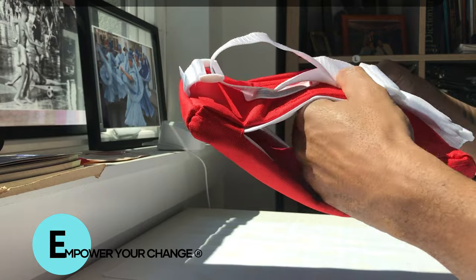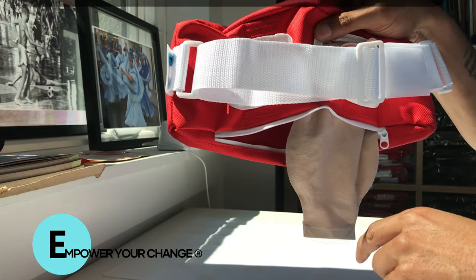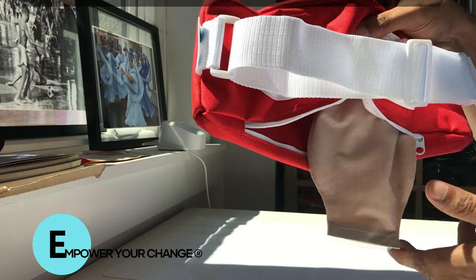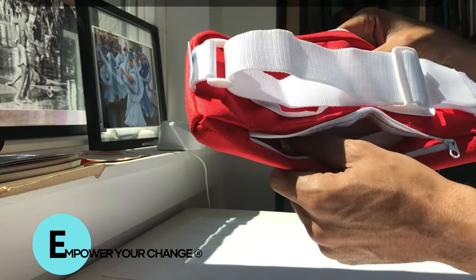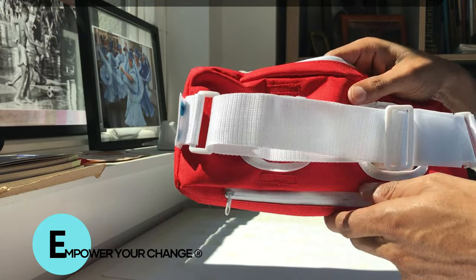If you want to change it, it's quick and easy. Once you finish, you can place your bag in the bottom side of it and zip it up and you're good to go.